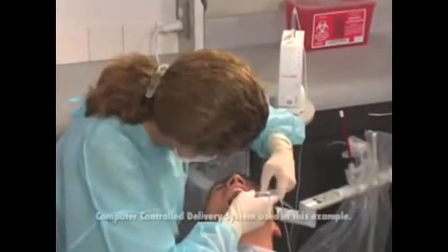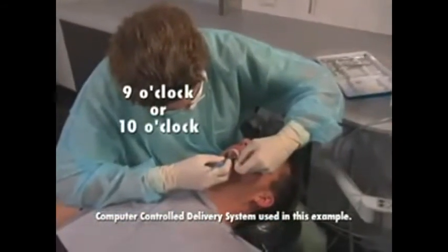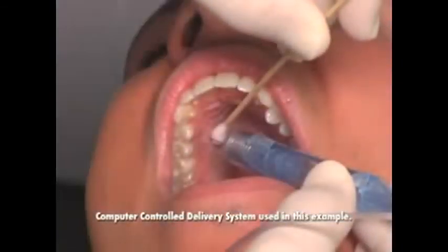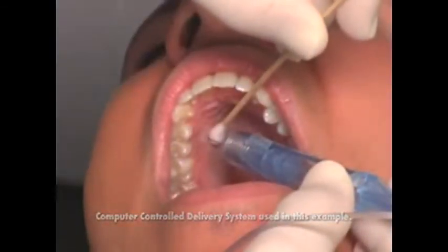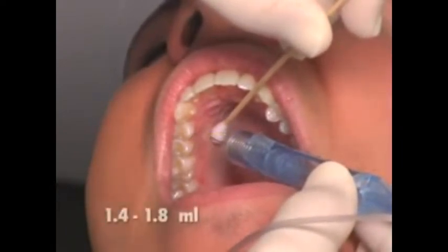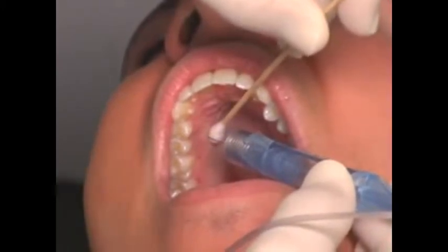For the AMSA nerve block, sit at the 9 or 10 o'clock position, facing in the same direction as the patient. The needle is inserted into the tissues at a point halfway along the line between the premolars and the midline of the palate. 1.4 to 1.8 mLs of anesthetic is slowly deposited.